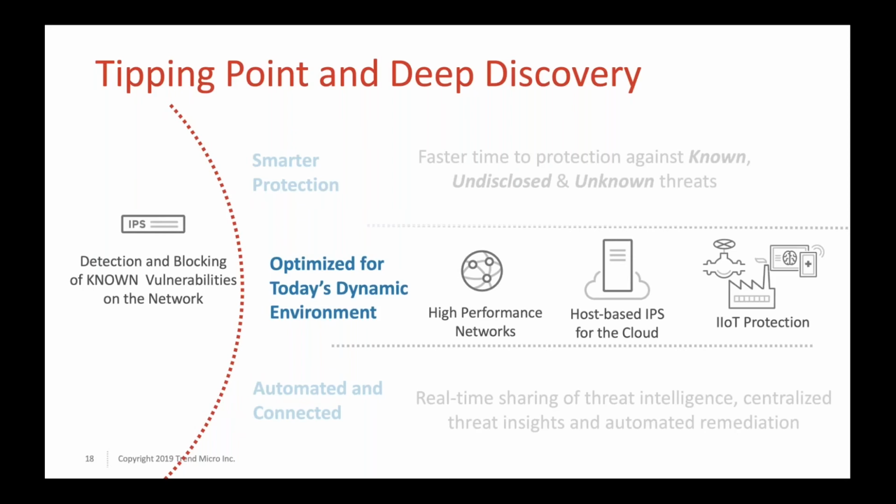I would say in the world of COVID, one of the big areas that I would strongly recommend, if you haven't, is making sure that anything that's coming in through a VPN is handled carefully, because a lot of companies and hospitals and everything else have expanded out the VPN throughput that people are allowed to connect to.